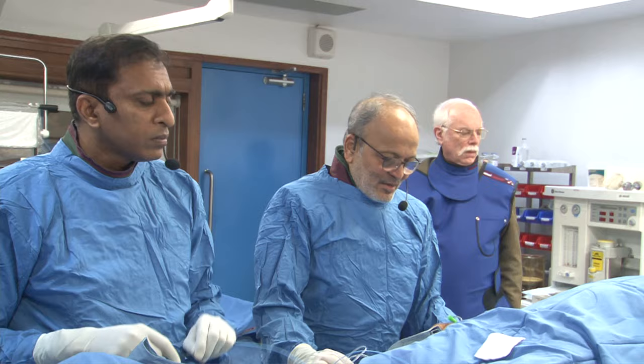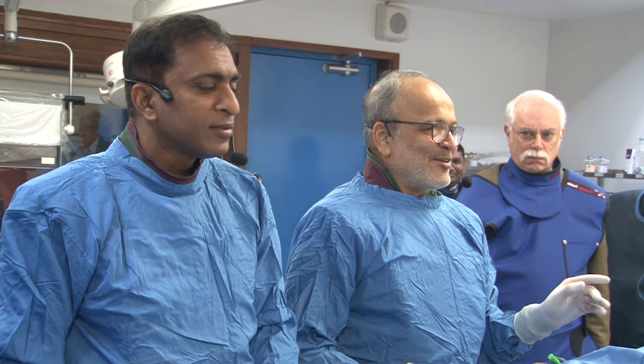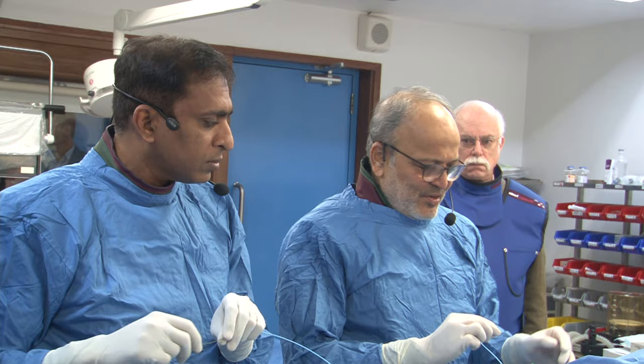With me is Dr. Rajni, and he has complicated my work by again puncturing the distal radial, and I have to work through arteria lusoria, so I will have very little effective length available. Rajni is with us since ages now, and he punctures practically 100% distal radial, and during the course of time we will show he is probably the best distal radial operator with us.